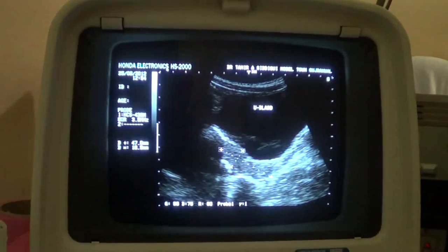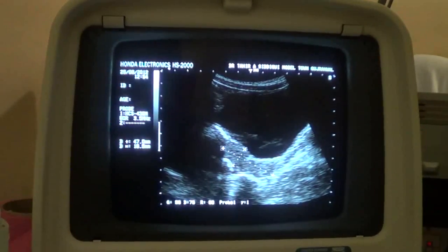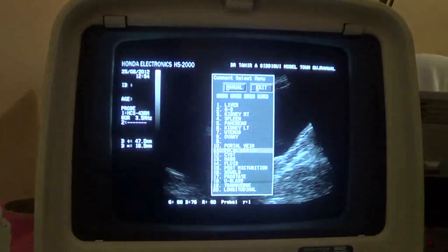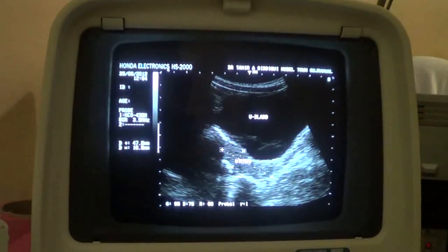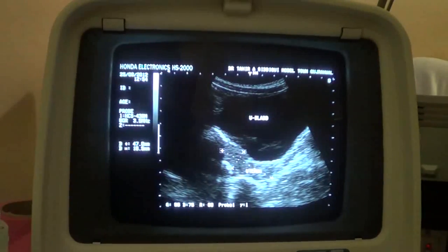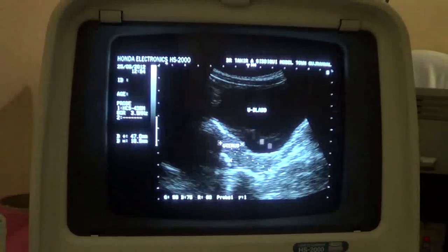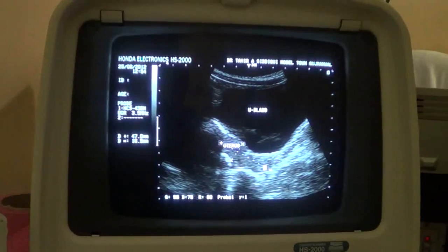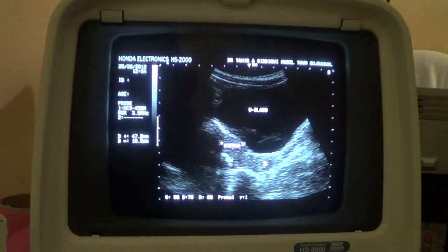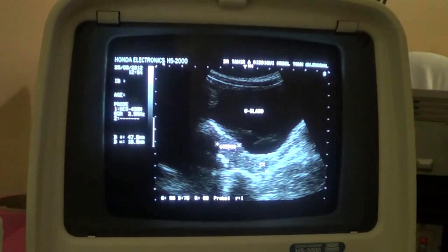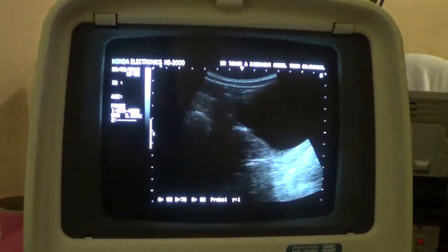This is the urinary bladder, this is the uterus in longitudinal section, and this is the cervix. So this is a hypoplastic, small-sized uterus in longitudinal section.